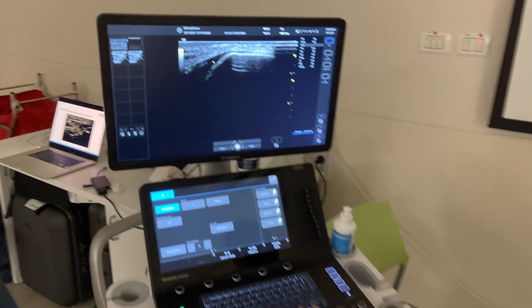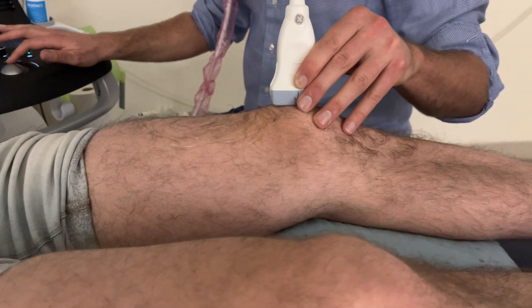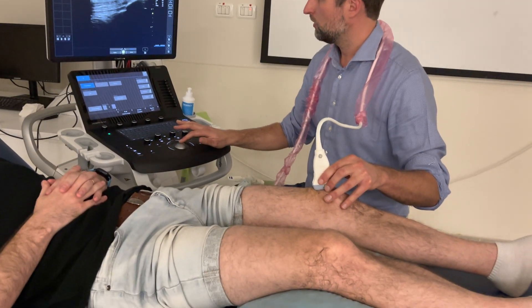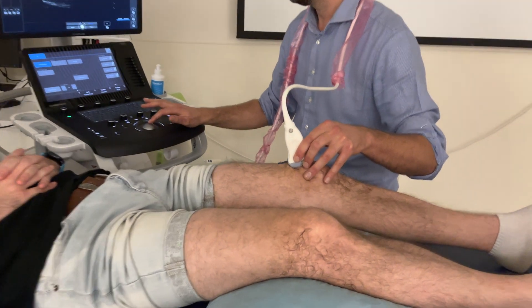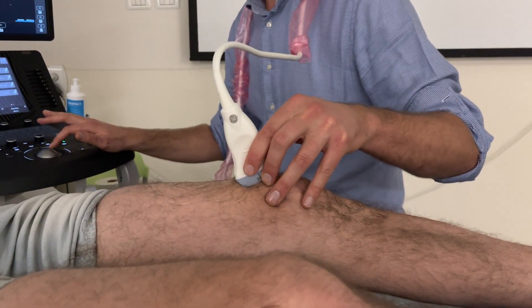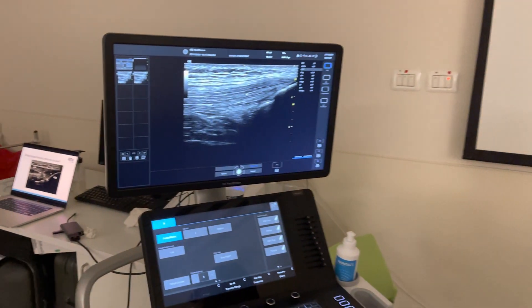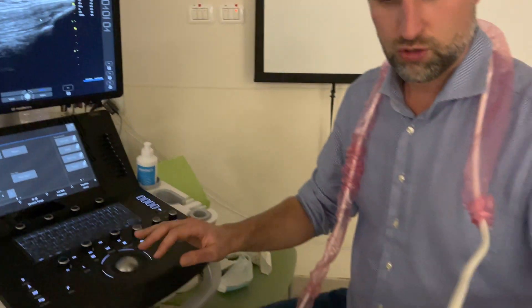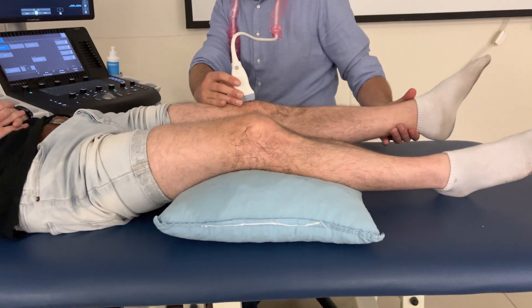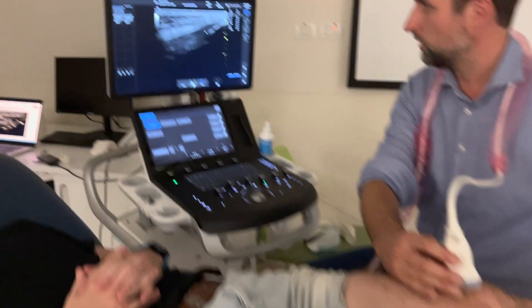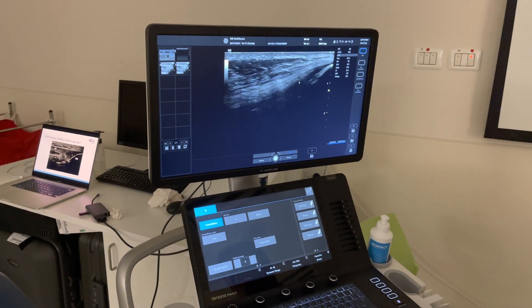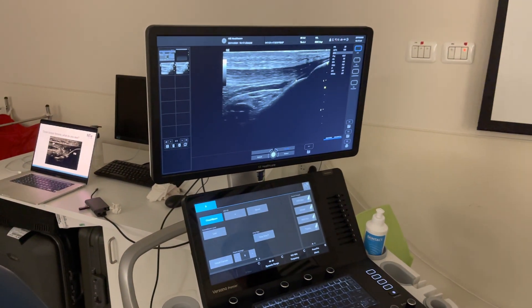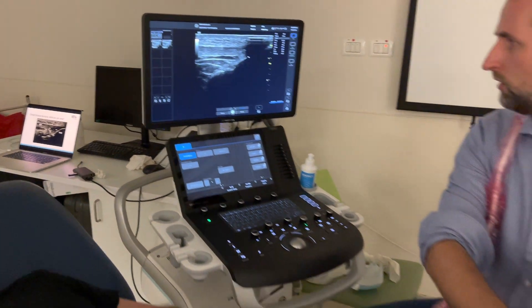Continuing this line proximally, we see it continues above the tendon of the quadriceps — because this is the quadriceps tendon now — it's completely anisotropy. The fascia line over it continues, and then here we can angulate the probe a bit to get a better view. Important — and I didn't say this in the beginning — is to do it in around 30 degrees of flexion. If you don't do this, the tendon is hanging very loosely and it's very hard to get a good image.